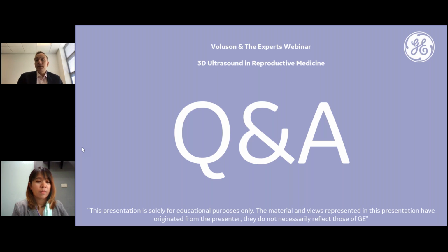So that's pathology. But the other thing that we're looking at really carefully now is endometrial pattern. If you look at all the studies in IVF, everybody is obsessed with thickness. So you measure the endometrium, and the latest data suggests if it's more than 7 millimeters, it's okay. If it's under 7 millimeters, it's a problem, and if it's 7.5, it's not a problem. I struggle with concepts like that. I don't think this is black and white. I think endometrial thickness has got relevance, but there are some people with thin endometria under 7 millimeters where that's normal for them, and there are some people with an endometrium of 8 or 9 millimeters where the endometrium is not receptive.